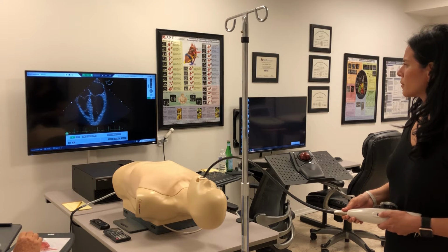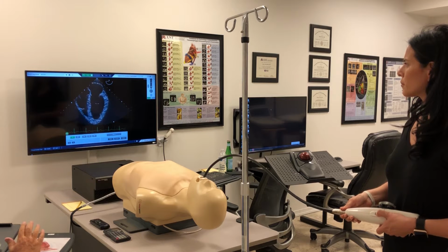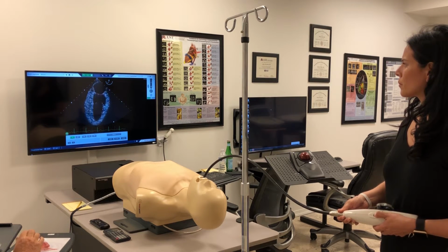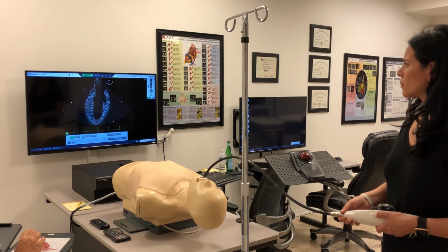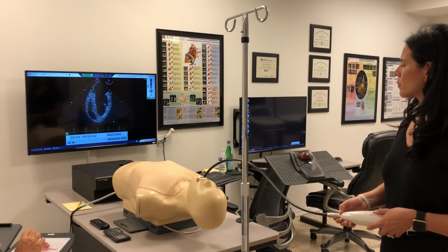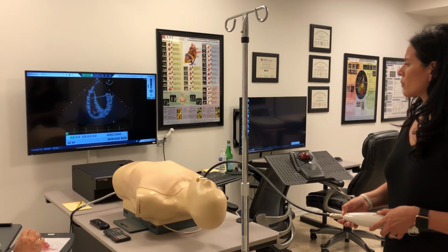Let's go ahead to the next view, which is the mitral commissure view, usually obtained around 50 degrees. So once we center the apex of the heart on the screen, just like you have it right now, and that's important, we'll go ahead and omniplane up to 50 degrees. Good. Then we'll use slight probe rotation to get the true commissure view, where you see the A2 trapdoor, as some people call it, coming up in the middle of the P1 and P3 scallop.